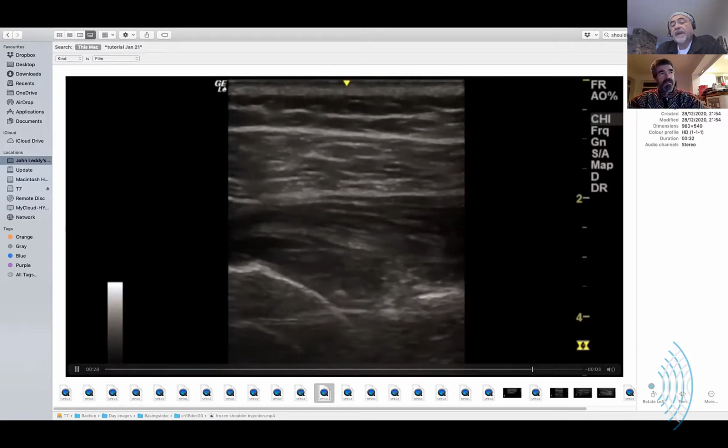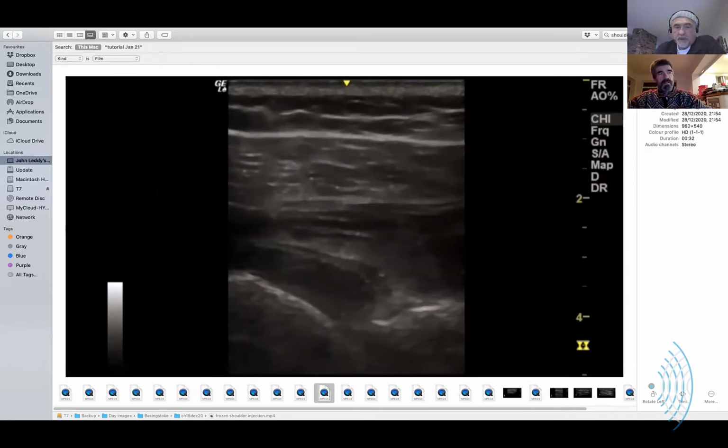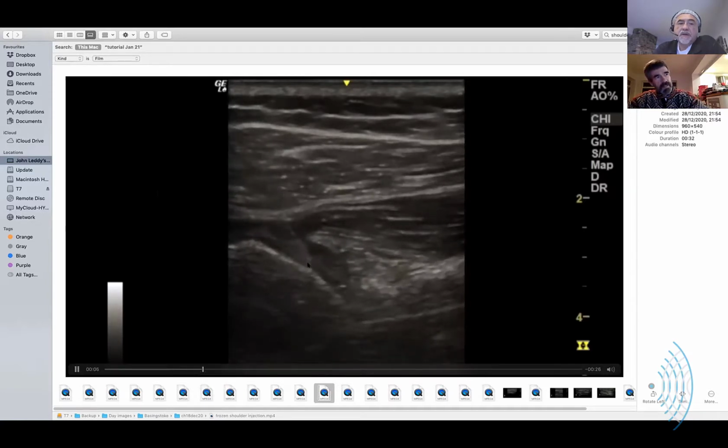Let me ask you a candid question. When you are doing these imaging, what percent of the time do you feel you have the actual needle imaged? With these, every time. You're seeing the tip of the needle. Yes. In here. Even these are quite deep injections, relatively speaking. They're down at 4 centimeters, so it's quite a steep approach. But when you come down there, you see the needle there.